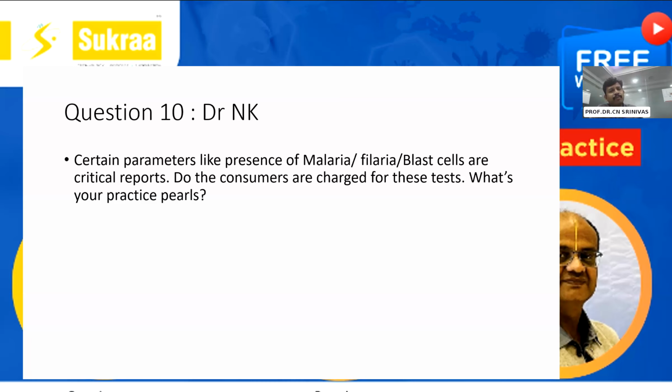So most of the time I have picked up malaria from a routine CBC rather than when the patient is suspected of malaria on a smear itself. But as a doctor, you are entitled to care for the patient. So I would say treat every sample as a patient. It's as though the patient is asking what is wrong with me. So when you find something which the patient has not asked for, it is a duty to inform what is wrong, why, and whether the patient is required to consult his physician immediately or not.